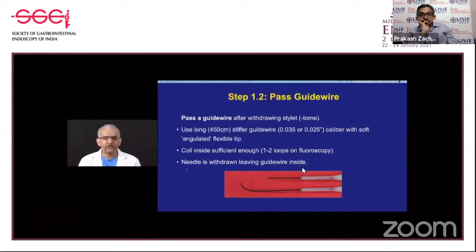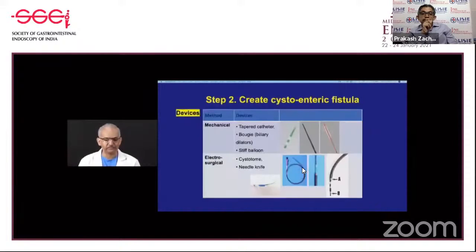So once you have the guide wire well inside, then you withdraw your needle, leaving the guide wire inside, and this movement has to be in a coordinated fashion with your technician so that you accidentally don't pull out the wire, because then we have to start all over again.